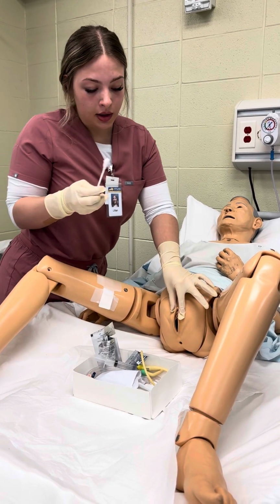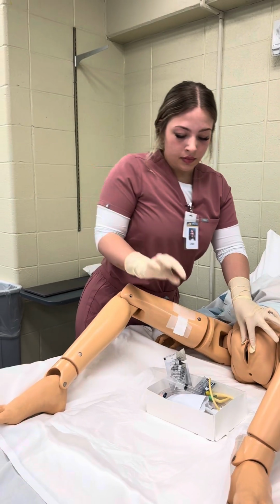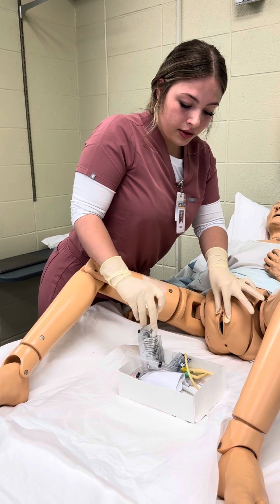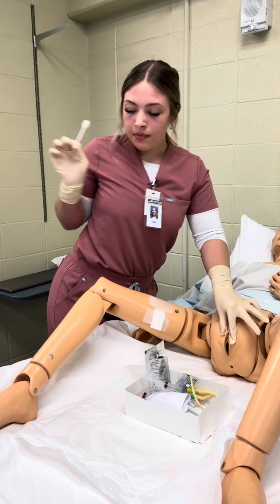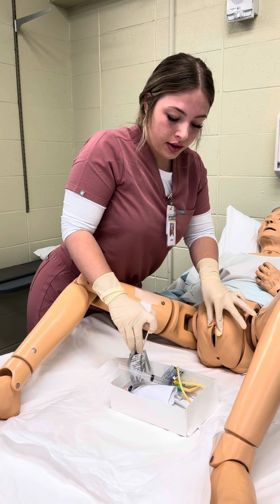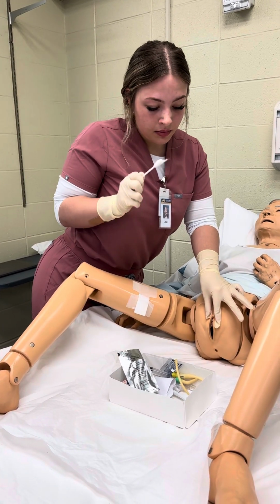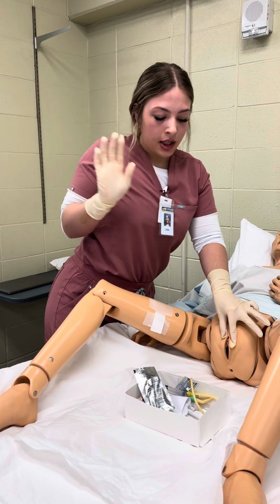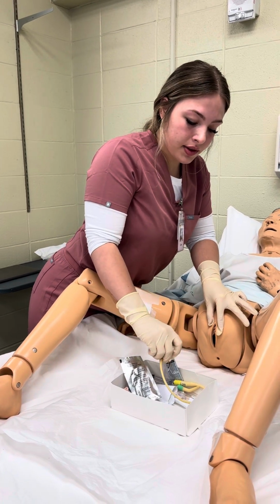I'm going to cleanse the outside. I'm going to take another swab and cleanse the inside. And then I'm going to take the third one and cleanse the middle. Keeping the labia or the meatus exposed.